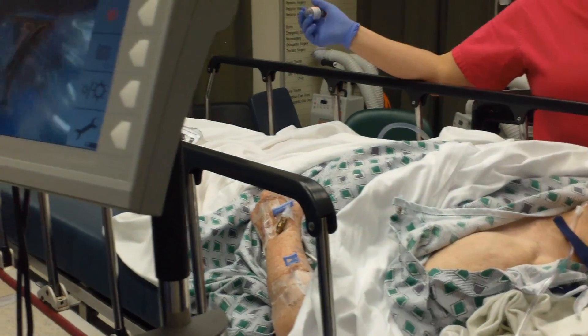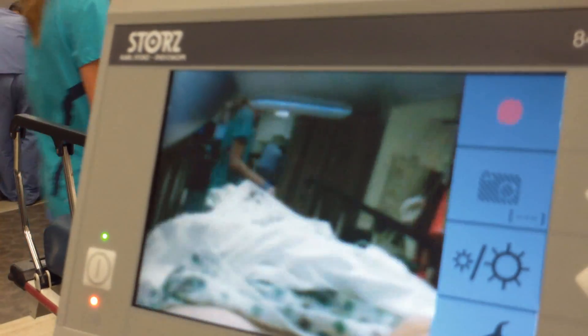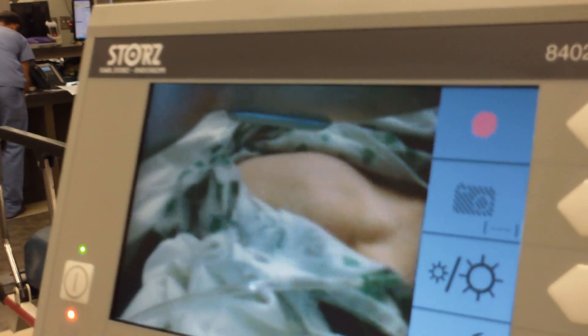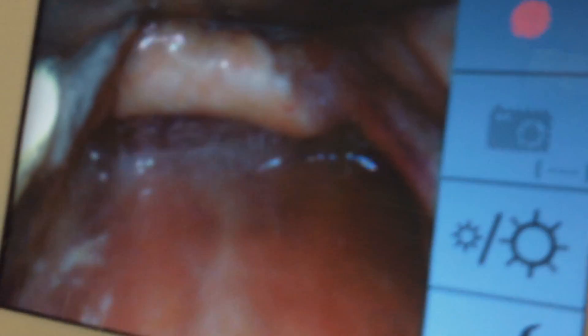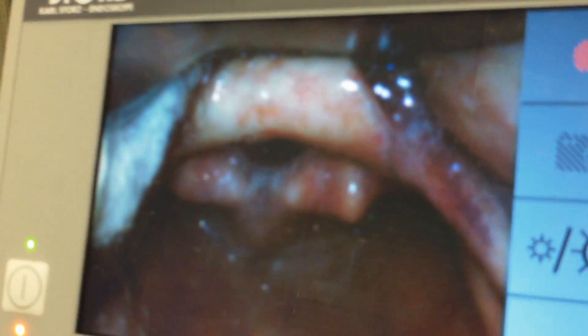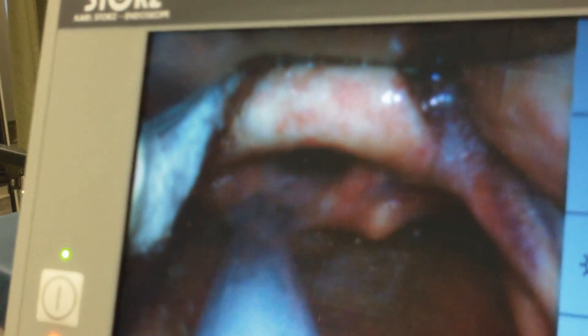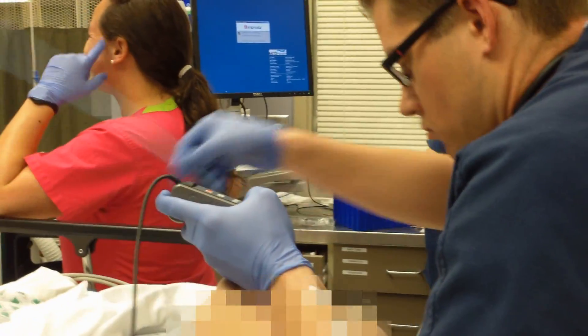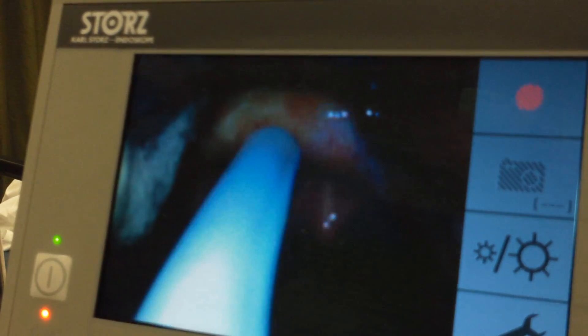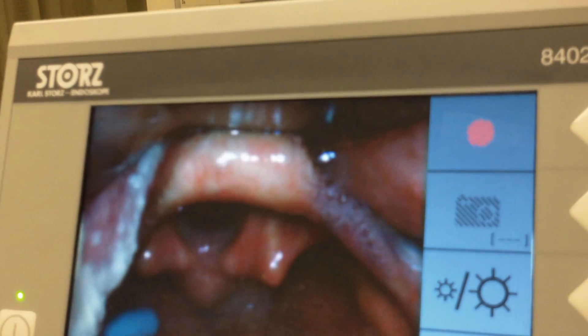Okay, you have your bougie out and ready? We're going to be watching him — he's not going to be watching. Put your bougie in. You see cords? We see cords.